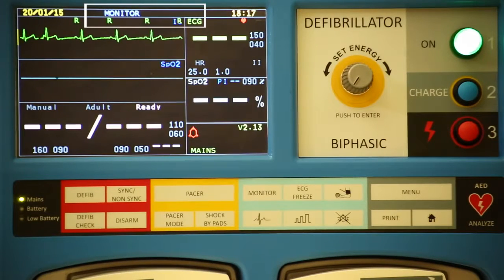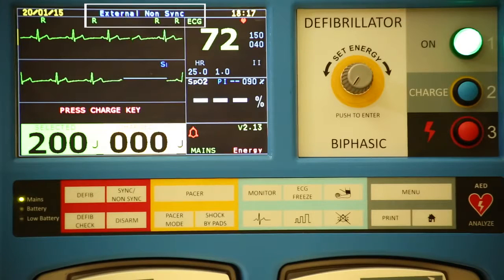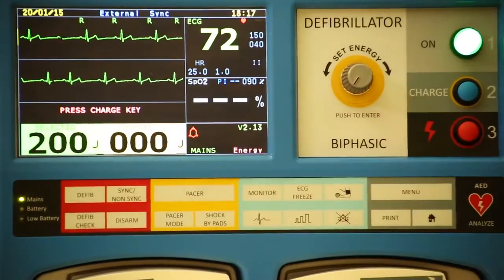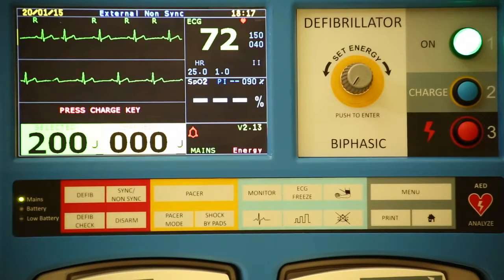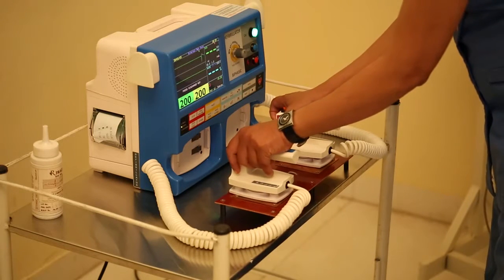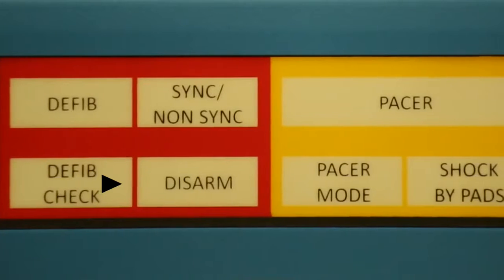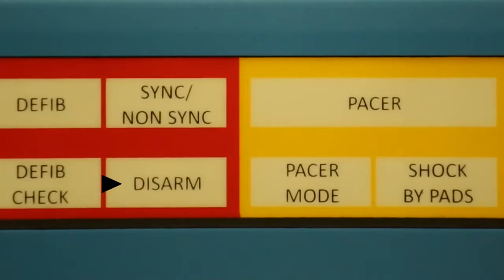If the unit is in the monitor mode, pressing the defibrillator button brings the unit in defibrillator mode. The sync non-sync button helps in switching between synchronous and non-synchronous modes of the unit. The defibrillator is in non-synchronous mode by default. When the defib is charged for the shock, but the decision of not delivering the shock is made at the last moment, then the disarm button should be pressed. The disarm button discharges the capacitor through internal circuit without delivering shock.